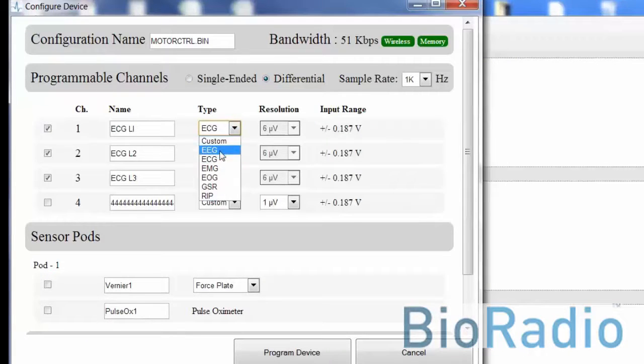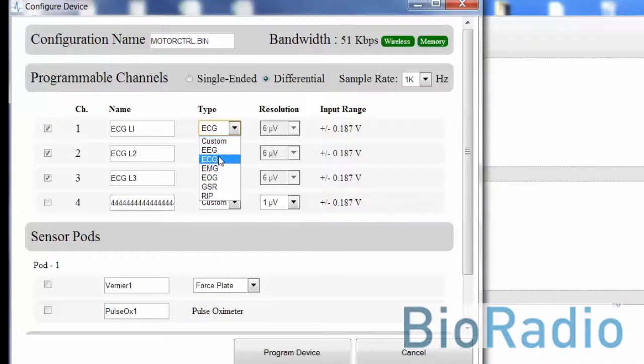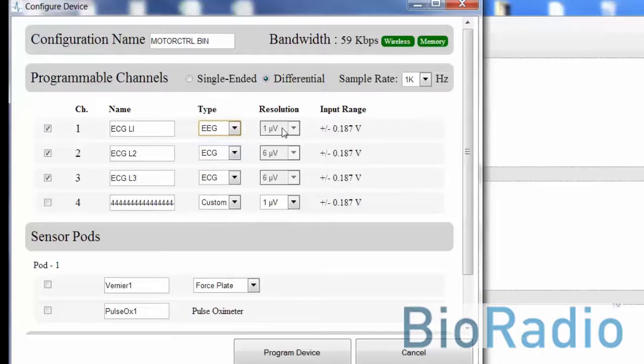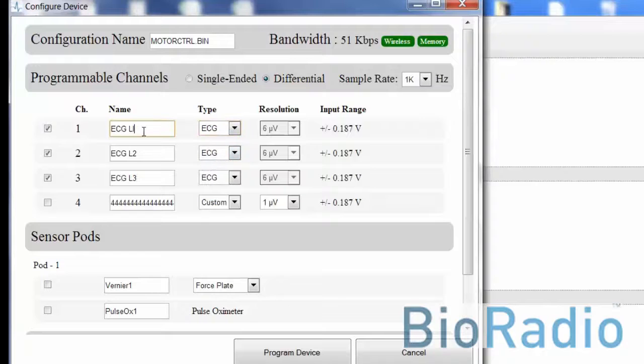You can select the different signal types by clicking onto the dropdown. For demo purposes, though, the difference will be in acquiring the proper resolution rate as seen there between EEG and ECG.